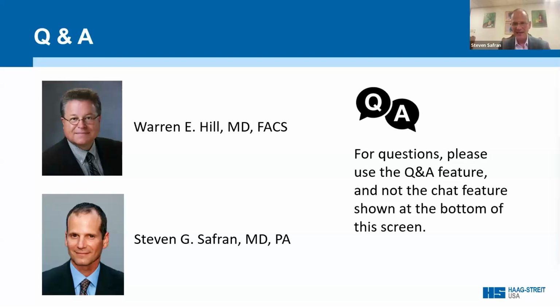I'm looking at the AC depth and saying, why is the AC depth 1 millimeter less in one eye than the other eye? What's going on with the zonules? Have you ever been hit in the eye? Why are the corneas so flat? Did you ever have LASIK? Oh, I had something done. Yeah, I think I did. These things come up as you look at the numbers being generated. You can see that there's a lot of irregularity and it's not reproducible. Then you can go back and look specifically at the ocular surface, stain them with lissamine green, and get a better idea of what's going on.